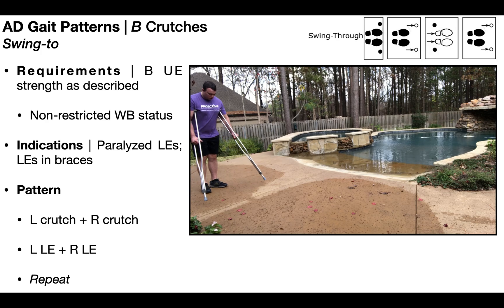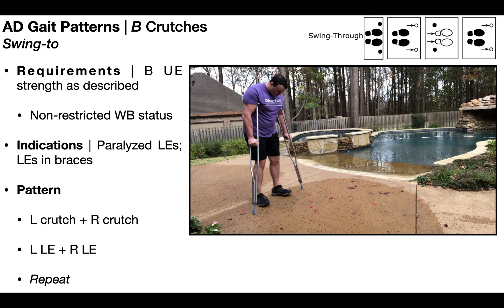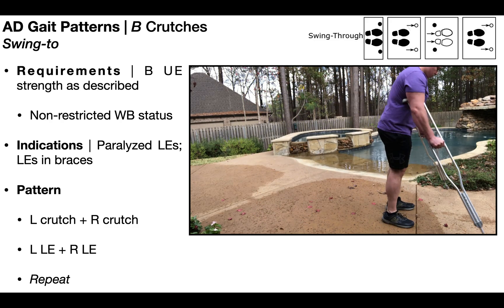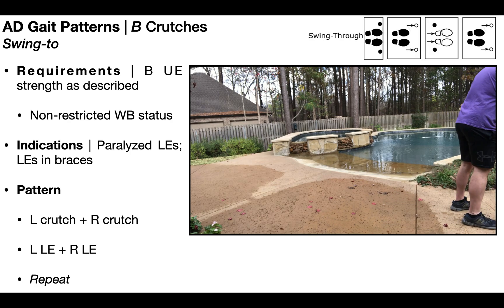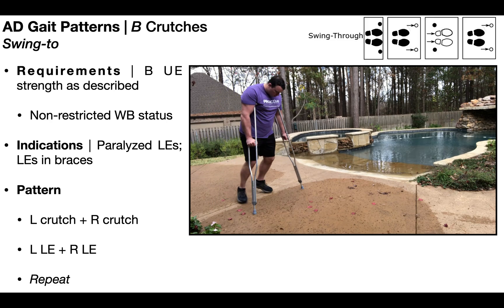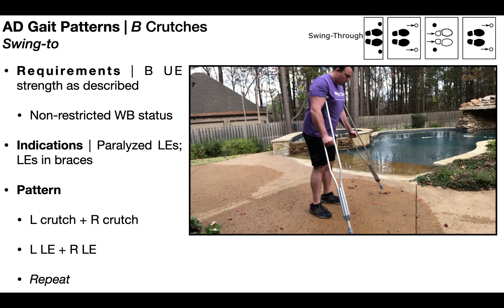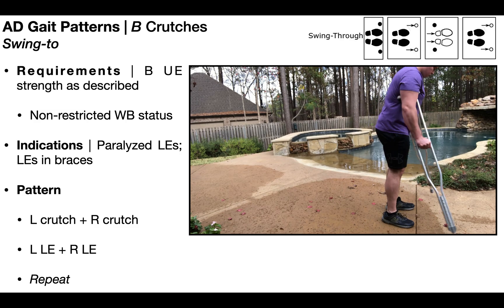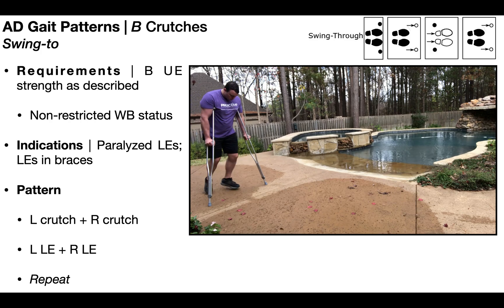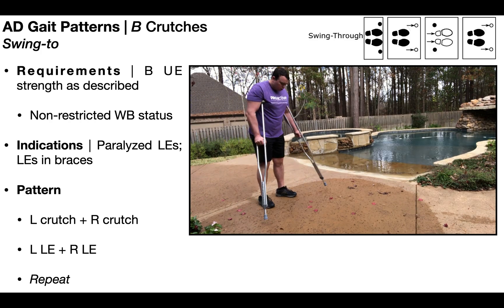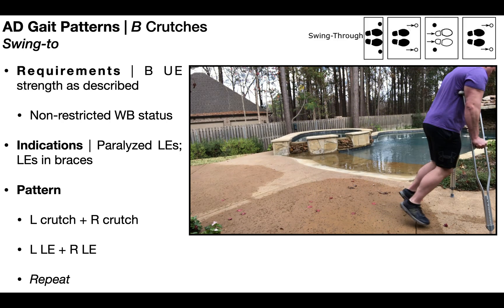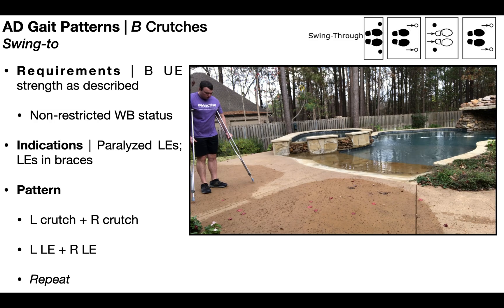Now let's take a look at the swing-to pattern. The first step is advancing both assistive devices at the same time — so first the left and right axillary crutches. Then, after you advance the assistive devices, you advance both legs at the same time. So basically: both crutches, both legs, both crutches, both legs, and repeat. This is termed the swing-to pattern because the legs advance just to the level of the crutches or the assistive devices.